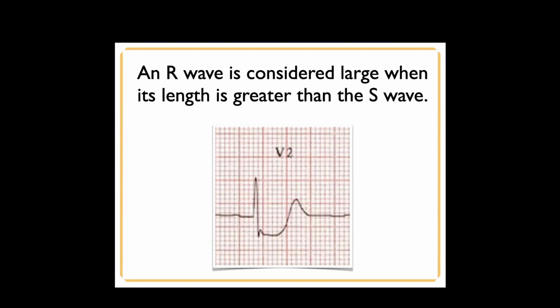Now, here's the thing: we don't change our treatment with a posterior STEMI. I know there must be some, because I've seen pre-hospital where they move the leads around. But generally speaking, I don't think it's a good idea to move the leads around, and let me qualify that a little bit.